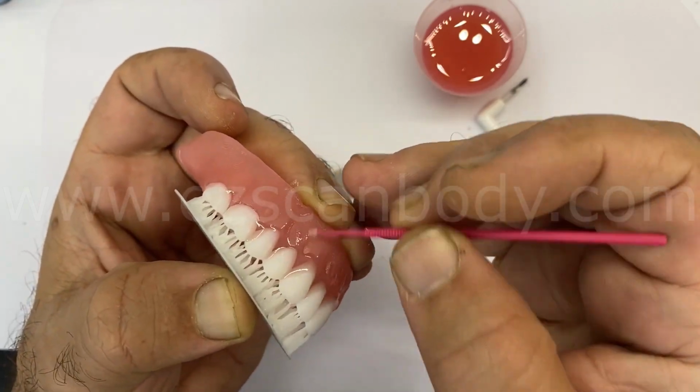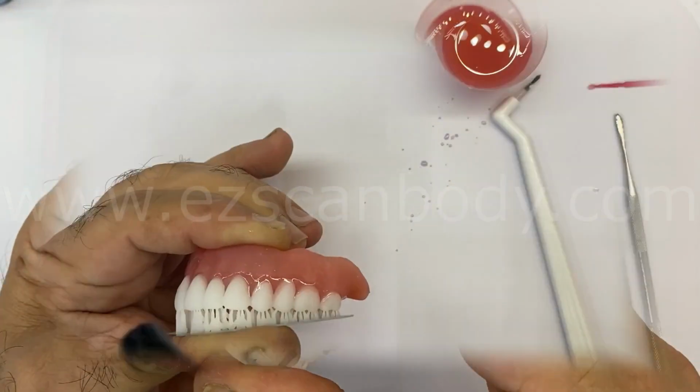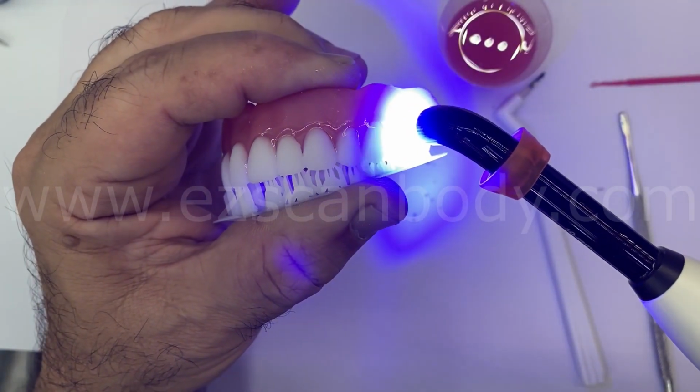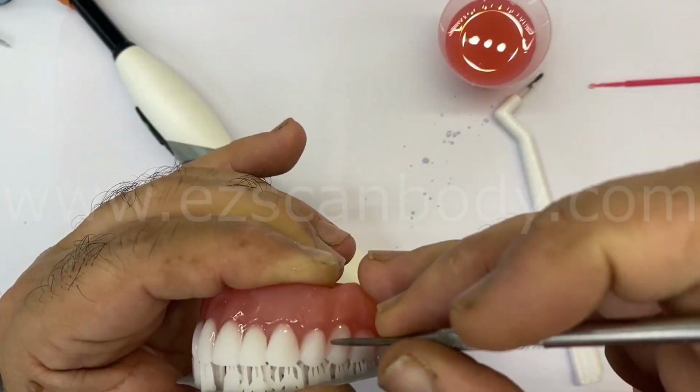Make sure to fill all the gaps between the teeth and check each one to ensure they are fully pressed in. Use a proper light cure gun and ensure you are wearing the correct eye protection. Fill any bubbles and prepare the denture for the post-processing light cure unit.